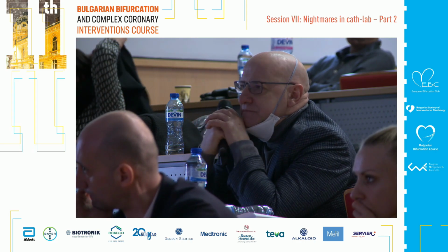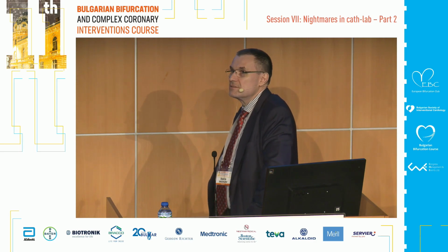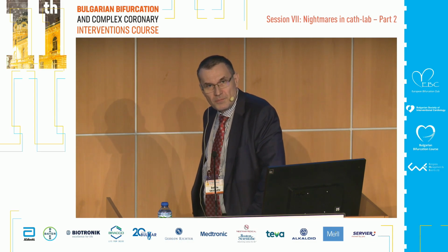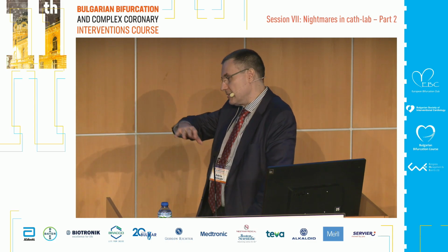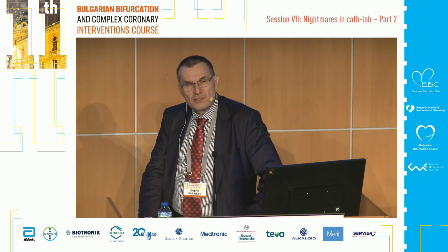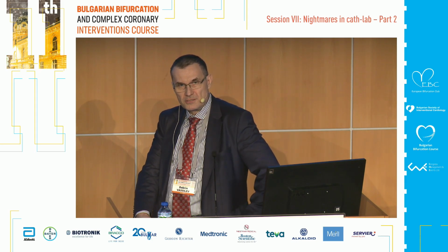The problem here was that when I decided to do rotablation, the patient was hemodynamically almost collapsing, and during the rotablation, at the moment when the burr went inside the stenosis, she just crashed. No, you cannot. It is very difficult to do rotablation in this situation.